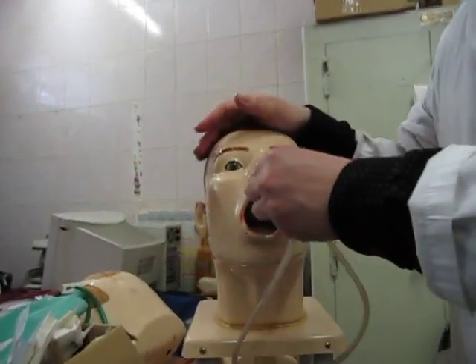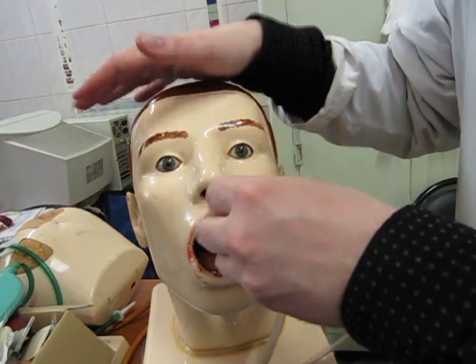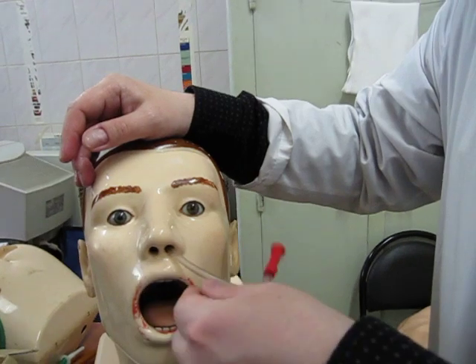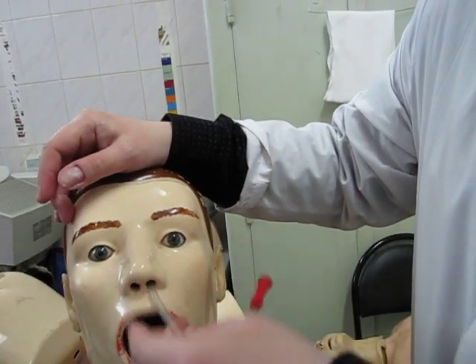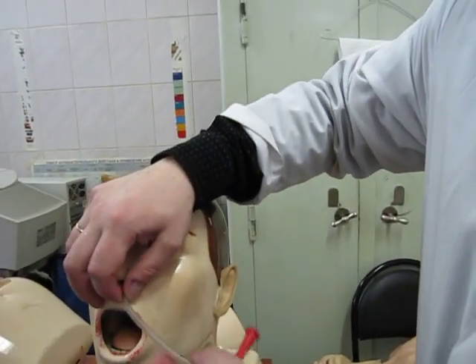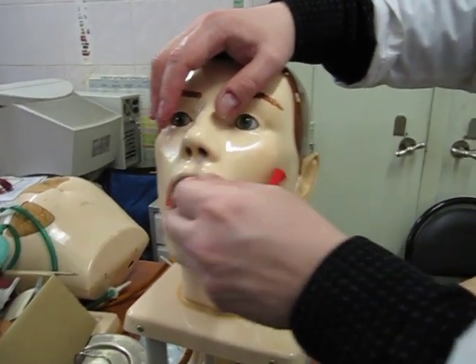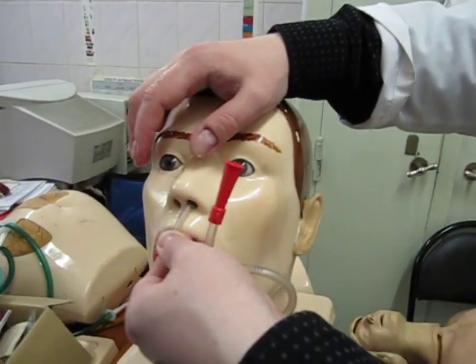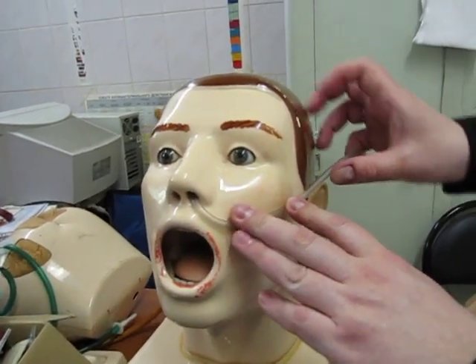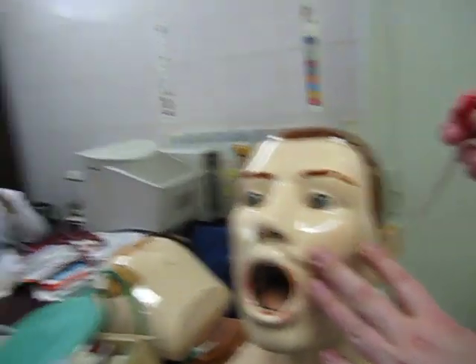To insert the tube, we usually fix the patient's head to prevent movement, then advance the tube to the bottom of the stomach. We start at the single mark and advance to the double mark — all of you can see the second mark. Only at that point do we fix the tube to the skin.